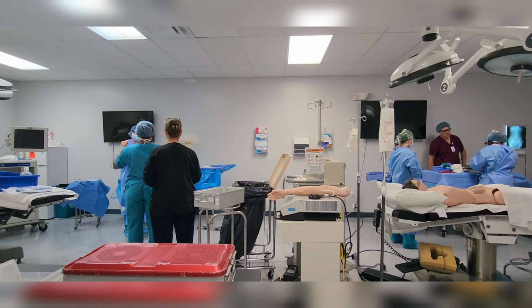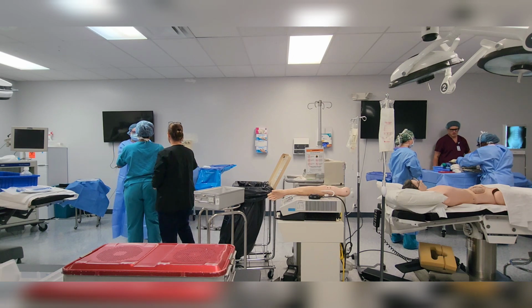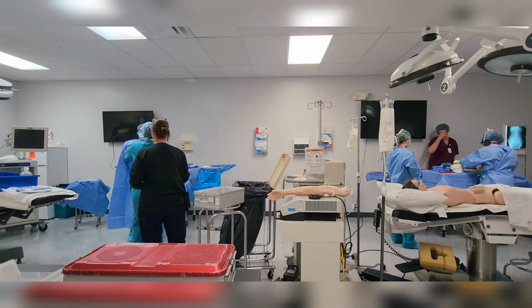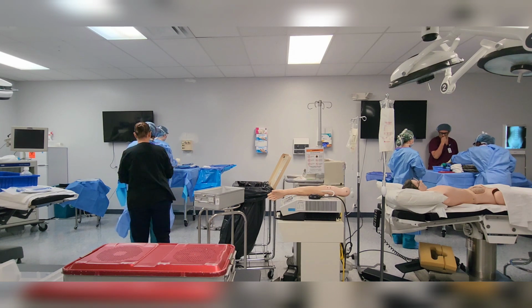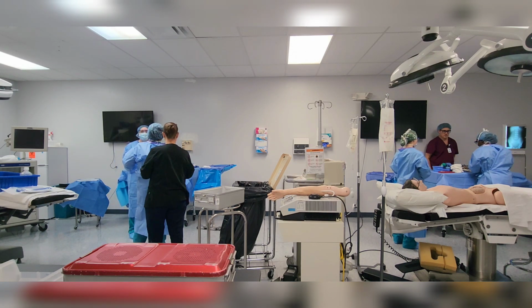So like the surgeon would be like, why do you look like you don't know? It looks like a Russian. No, she's right. How you always know is this will be on the inside. There you go. Okay. Retractors. Retractor 1, 2. And then you're going to go right for gowns or gloves. As soon as you put that on, oh, you didn't get gloves. Oh, it's in your pocket.